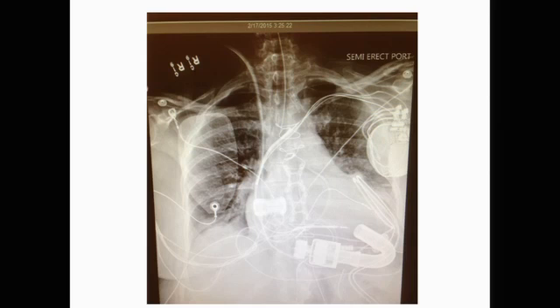There's an inflow cannula, the impeller of the device. It's actually got a flow meter built into it. That little block right there is the flow meter in the outflow tract. It's got a smaller impeller than even the HeartMate 2, and so the idea here is it'll have a little bit more pulsatility. It's got 2 different inflow cannulae, 2 different outflow cannulae, so you can insert this in very small patients, as small as 35 kilograms. So basically even adolescents can get this device. It's in clinical trials, like I said.